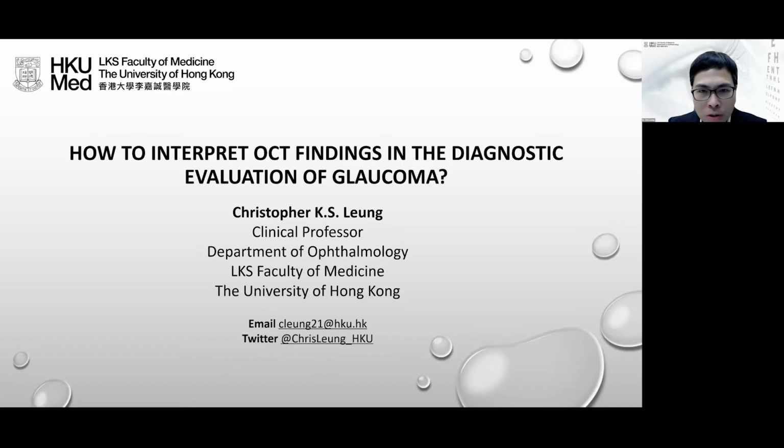In this webinar, I'm going to share with you some practical tips on how to interpret OCT findings in the diagnostic evaluation of glaucoma. OCT is a bread and butter technology in glaucoma care, but it is also a very confusing technology to a lot of people, because we have so many different OCT models and different parameters and also different regions of interest to be imaged. So in the diagnostic evaluation of glaucoma, sometimes it could be difficult. And I hope the tips and pointers I'm going to share with you tonight would be helpful and relevant to your practice.